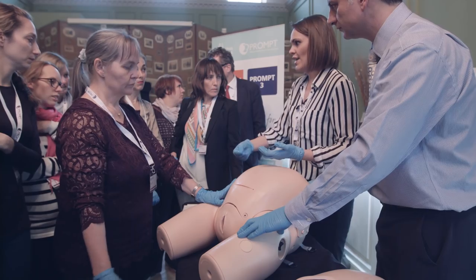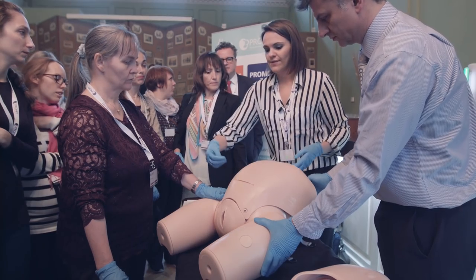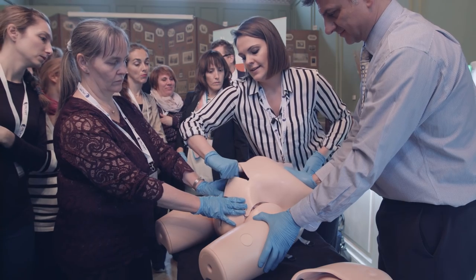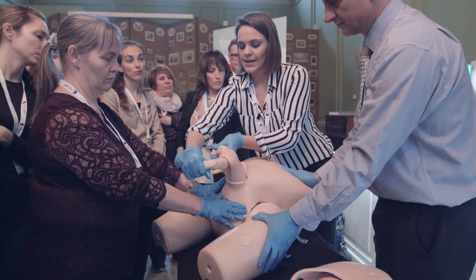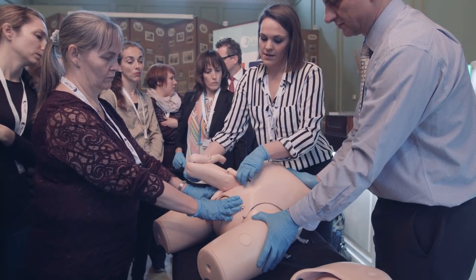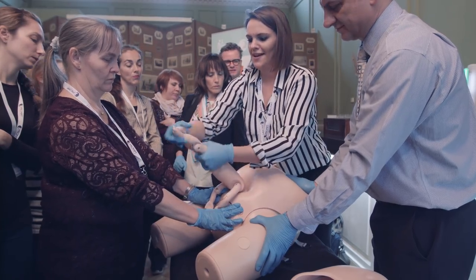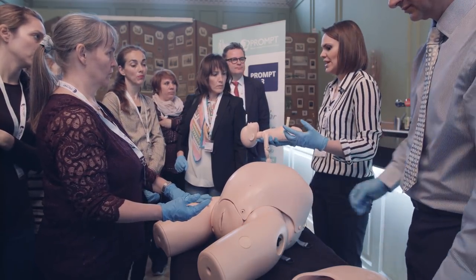If that technique has failed, or we want to try reverse breech extraction first, this is also really great for practicing that. I can feel I've got a hand there — I don't want that — and then there we go, got a foot. It's slippy, quite realistic simulating it, so I can practice the rest of my delivery. Hopefully when you're practicing you're not doing it from behind the baby like I am, but you can practice the maneuvers really nicely.